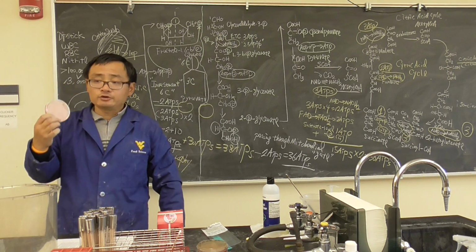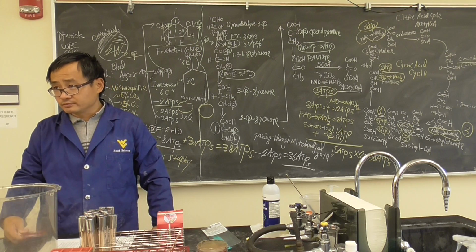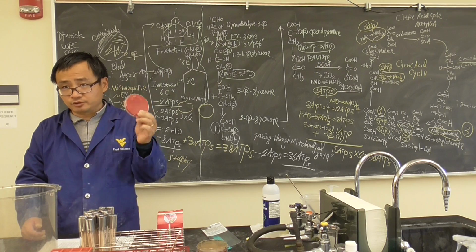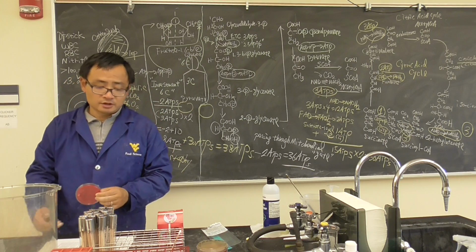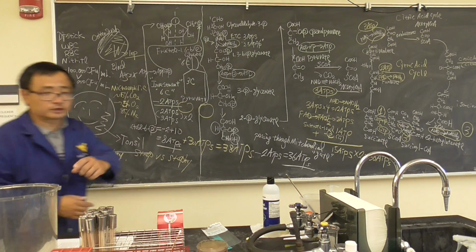Okay. Try your best to sample the tonsil area, not your oral cavity. Very important, at the back, label your three names' initials if there are three of you. If two of you, label your two initials and the bench number. Okay, so you can go ahead and do it. And the blood agar is all right here. And the cotton swab is right in the front. Okay.